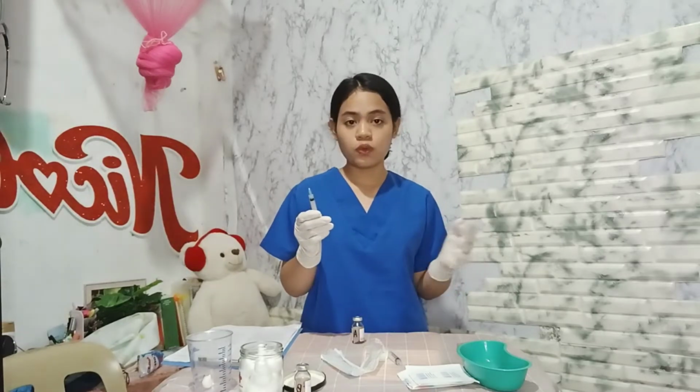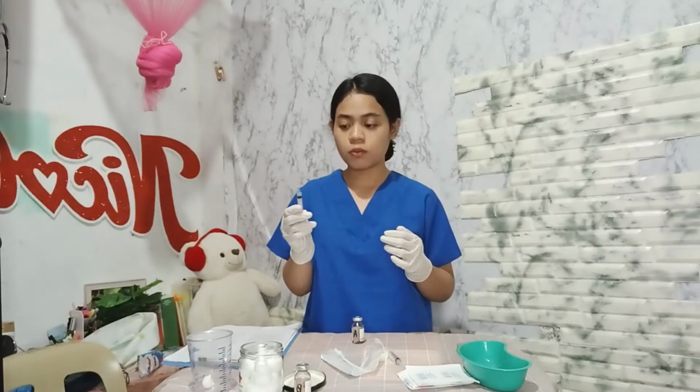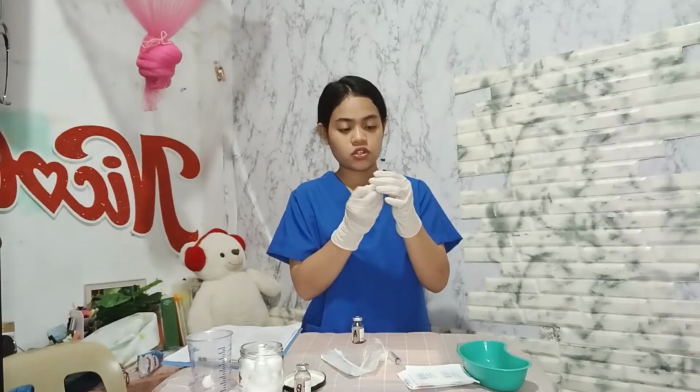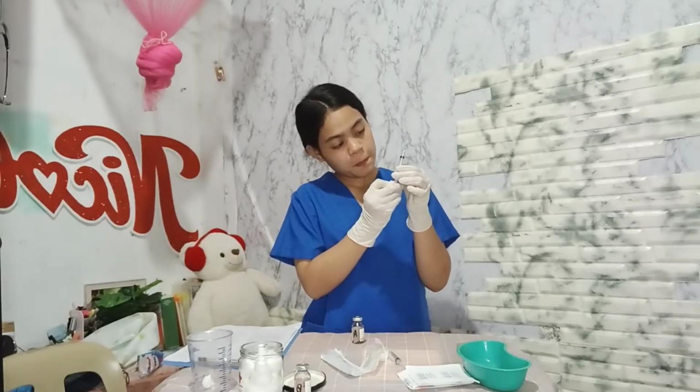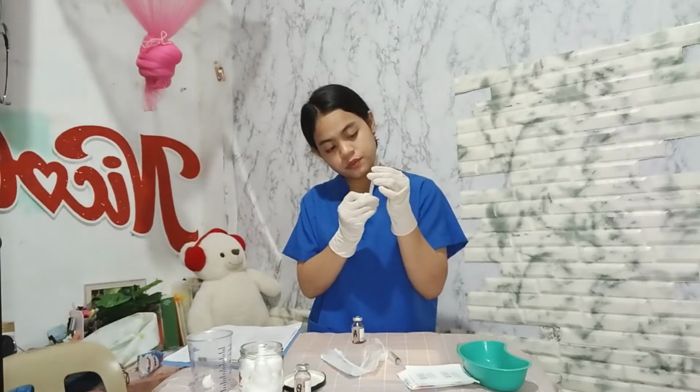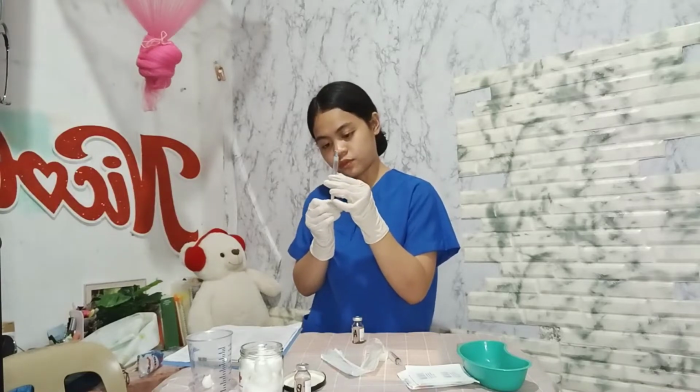We will need 3 ml of the antibiotic medication, so we will withdraw the air with the same amount of medication. Okay, this is already the 3 ml.